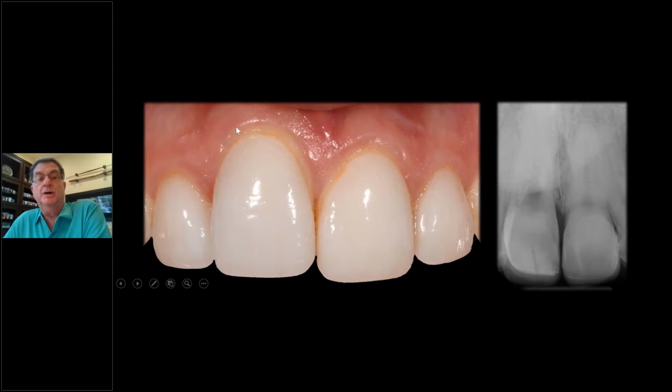Would you mind if the final case has the tissue 2 millimeters higher than this side? She says, not at all. I never bother with it. I don't look at it. I don't see it. And I put in writing that I had that discussion, because sometimes patients later on become very picky. So I said, okay, let's try it.